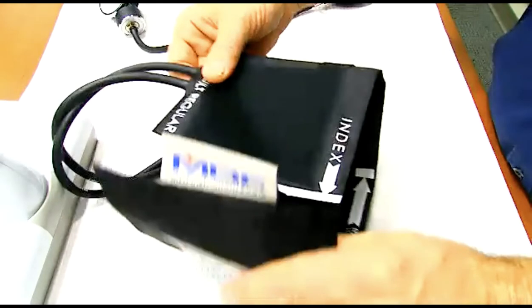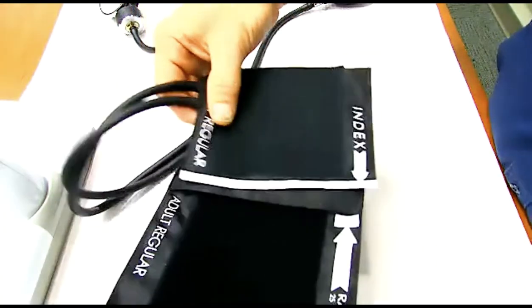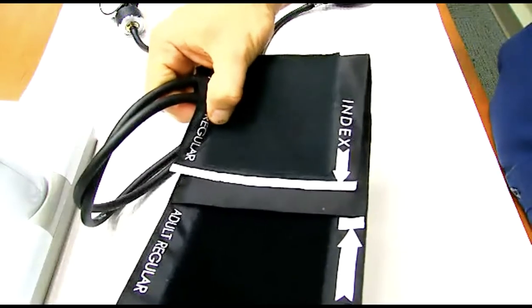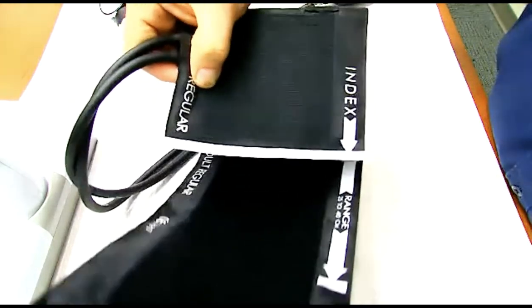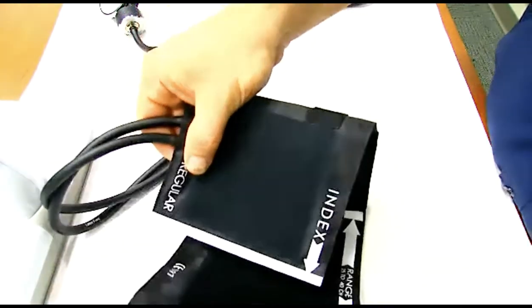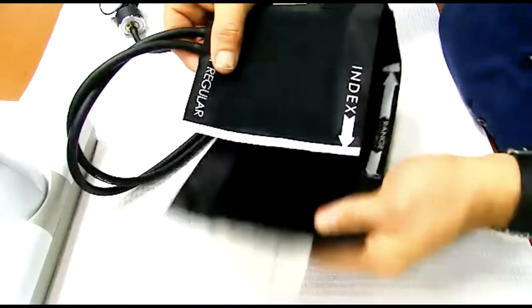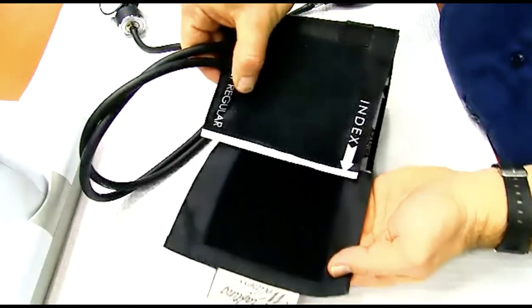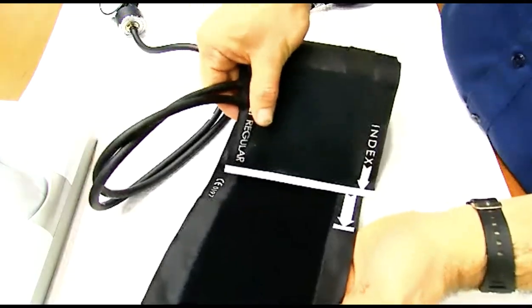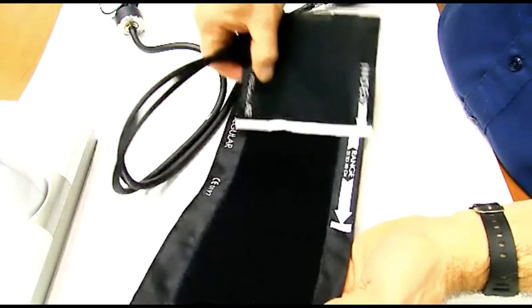As you wrap this around the arm and come to lift up, you're going to watch where that line is. So if you wrap this all the way around, then you can see that this cuff is way too big because the line is not inside the range. But if you're anywhere around here, before you wrap it over, that would be okay. But if you can barely get this cuff around, I mean, by the time you're right around here, you can see that your edge is not within the range. So as you pull this around the patient's arm, for it to be the right size, this white line will be somewhere within this range. So when you do this, it'll kind of make sense.